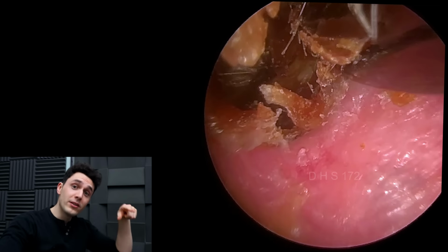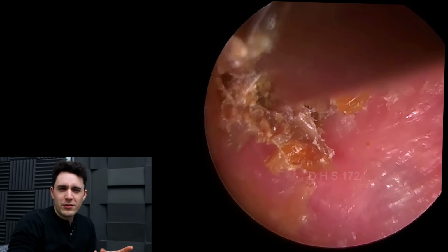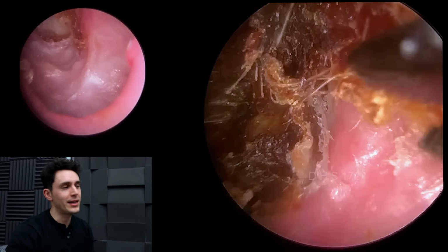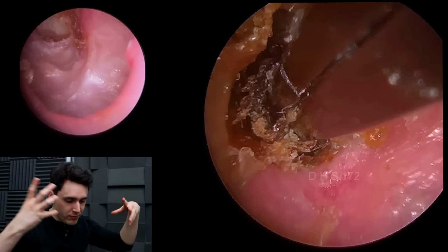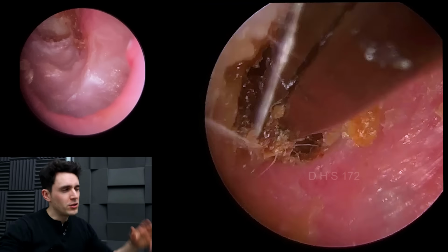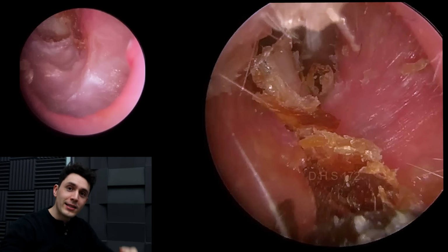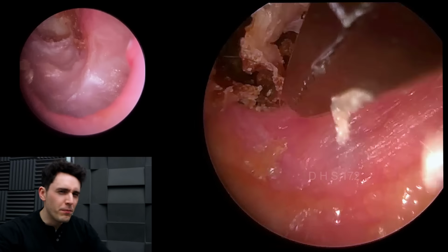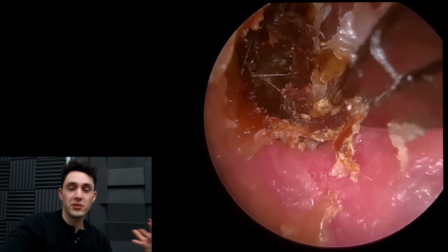Now at the end of the previous video, and I do encourage you to go and watch it, I felt like it was quite good. The ear canal had been cleaned nicely and he obviously has this huge crater here. It's what we would call a canal cholesteatoma. There is a very well defined trench or crater in the ear canal, which is just getting larger and larger. It's not a global widening like keratosis obturans. There is a defined pit in which debris is collecting. I couldn't really see any exposed bone or granulation. There was no pus or anything like that. But it is that canal cholesteatoma presentation.